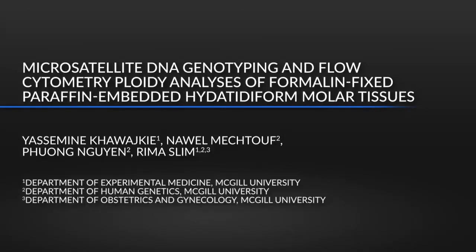The primary advantage of our genotyping protocol is that it minimizes contamination with maternal DNA, which is the main challenge when genotyping formalin-fixed, paraffin-embedded molar tissues. Flow cytometry is a fast and inexpensive method that greatly facilitates the diagnosis of Hydatidiform moles.